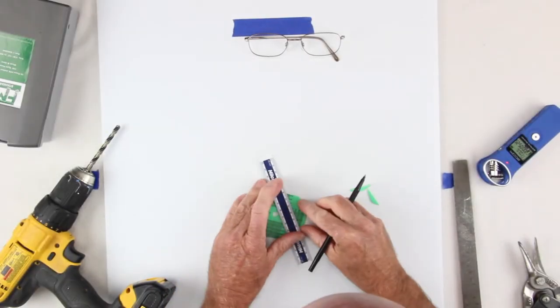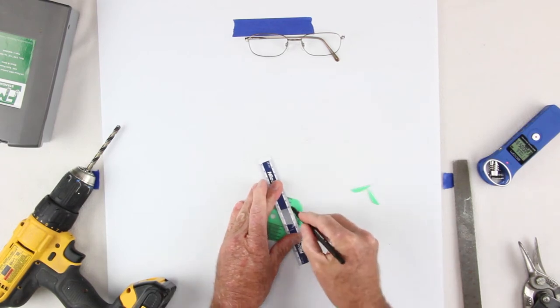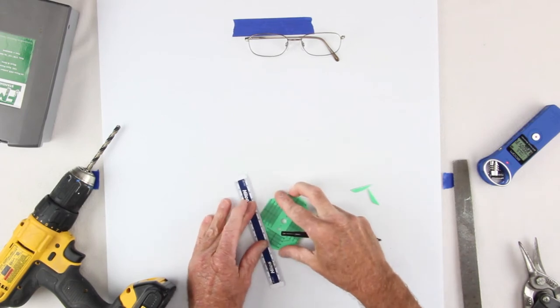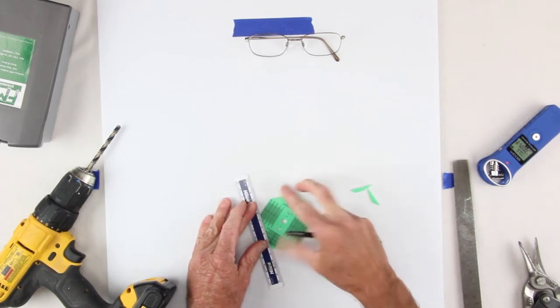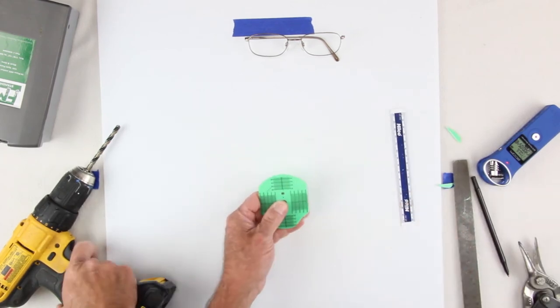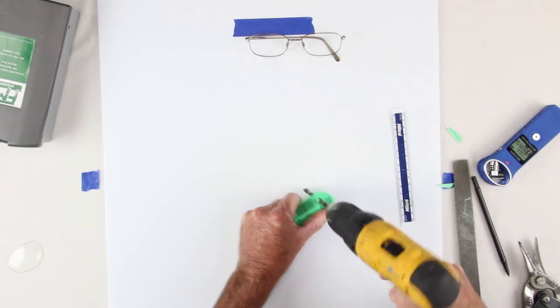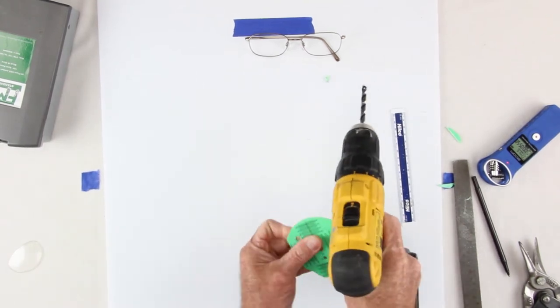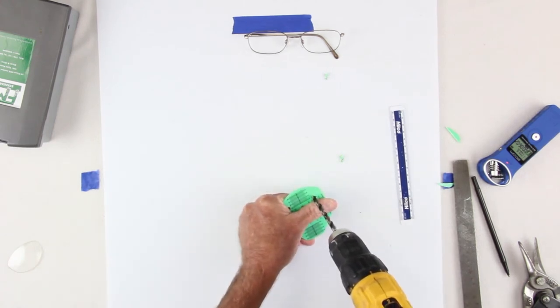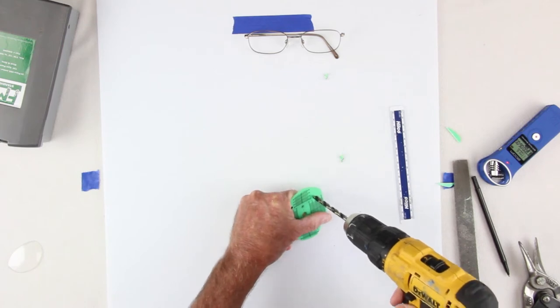And just keep in mind, all I'm doing here is playing. I'm trying to visualize what my final lens will look like. Play, experiment, have a little fun. Yeah, that looks pretty good. All right, drill a hole right there. That looks pretty good. Again, I would obviously probably do this in a vise, but my lighting, everything is good here.